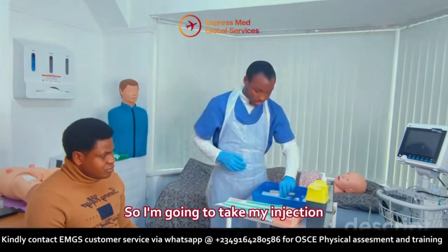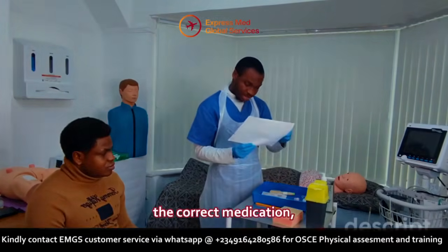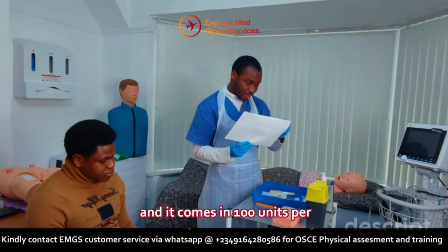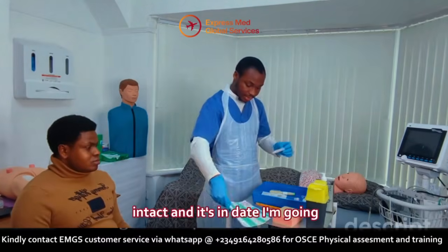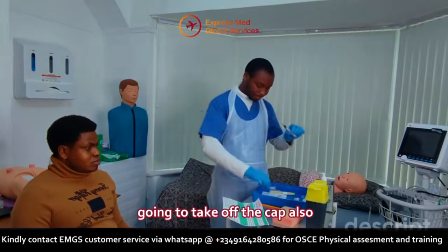Alright, thank you. So I'm going to take my injection and confirm it again with my prescription to be sure I have the correct medication. I have here with me insulin, and the dosage is 15 units subcutaneously, and it comes as 100 units per milliliter. And the expiry date is the 31st of 8, 2026. I'm happy to proceed. I can see that it's clean, intact, and in date. I'm going to be giving the medication. I'm going to take off the cap.